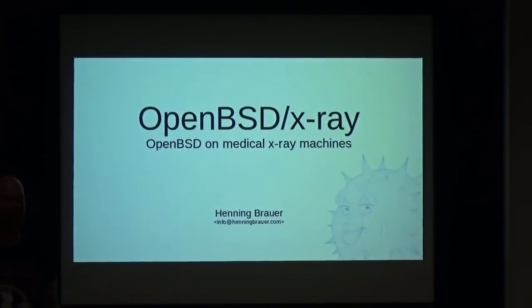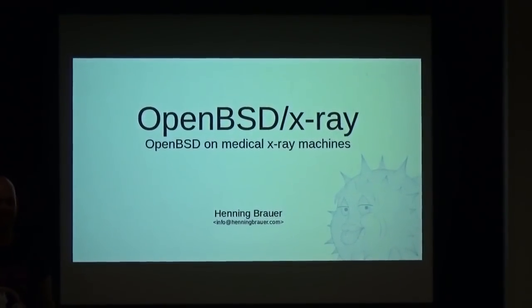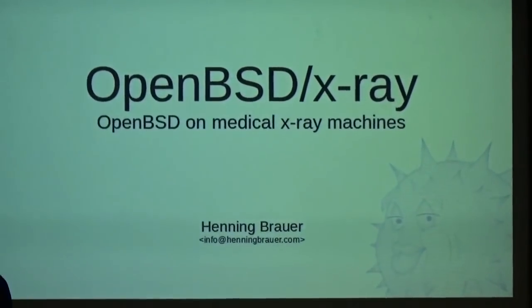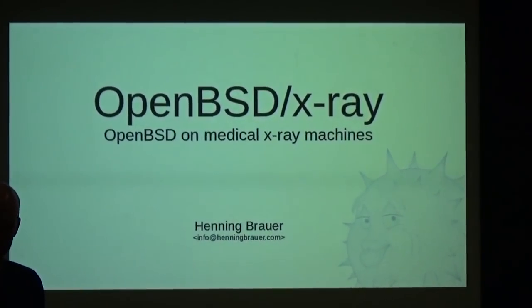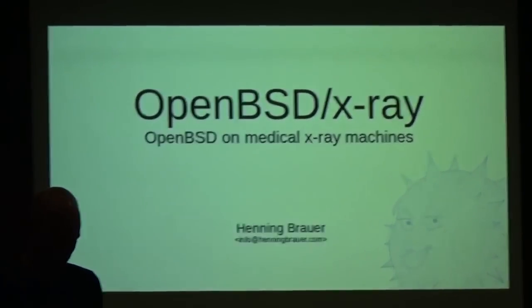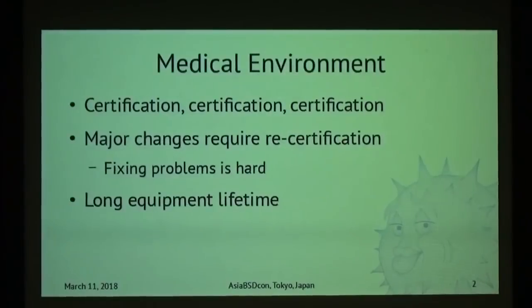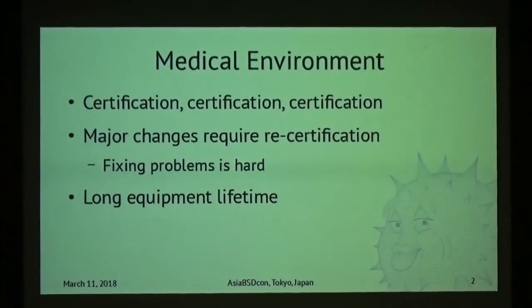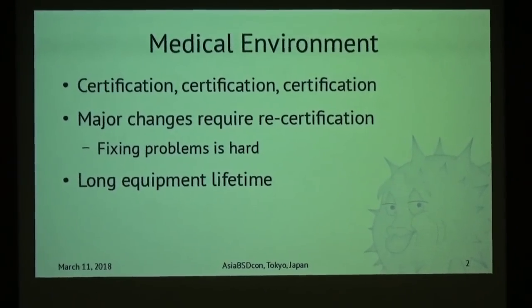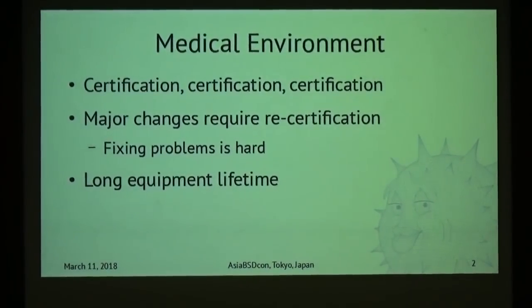I'm going to talk about a pretty, in my book at least, unusual use case of OpenBSD that I recently learned about from a customer, and that's OpenBSD running on X-ray machines. So, that means we're working in a medical environment which has pretty unique challenges.